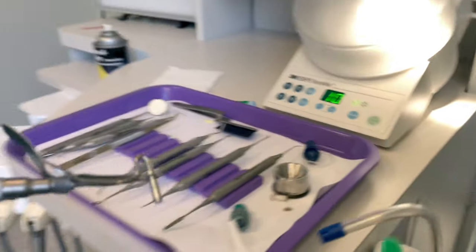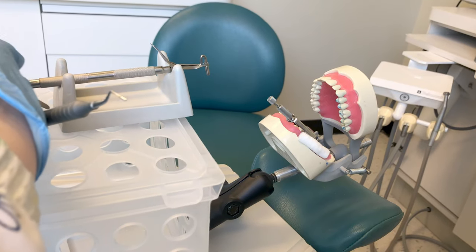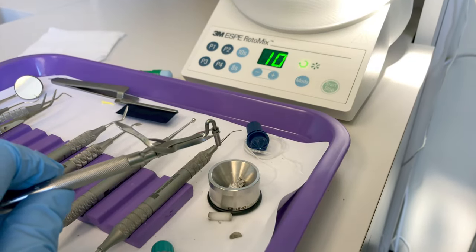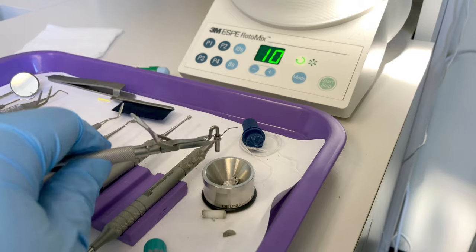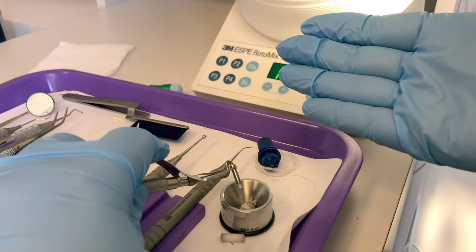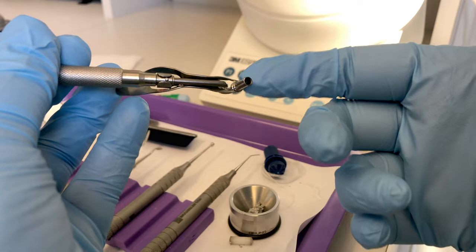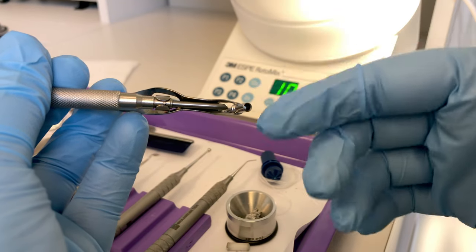Load both ends and re-deliver to your operator. Take the old instrument, tuck, deliver the new item. Remember they're going to need the condenser back right away — take, tuck, deliver. Once the doctor places as much filling material into the preparation as necessary, we're done delivering the carrier. If you have material left in your carrier, empty it out at this point before it hardens. Sometimes assistants forget, it goes through autoclave, and you're stuck with a solid chunk of amalgam in your carrier.